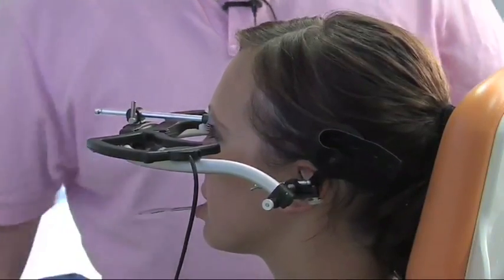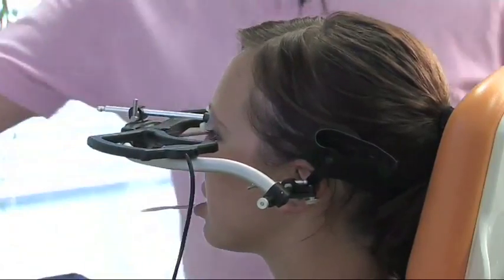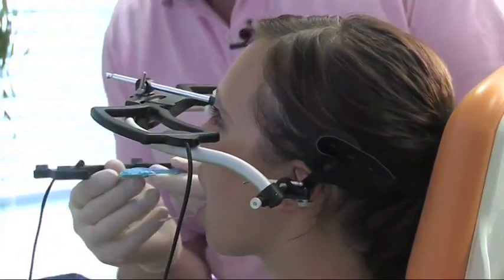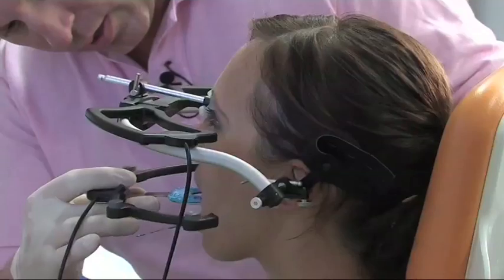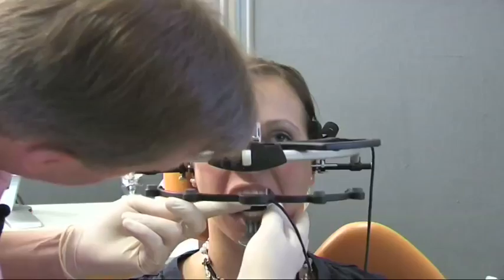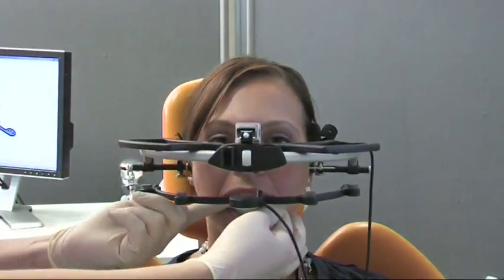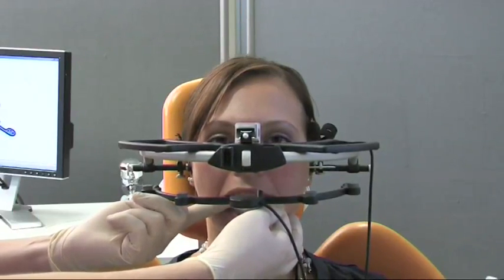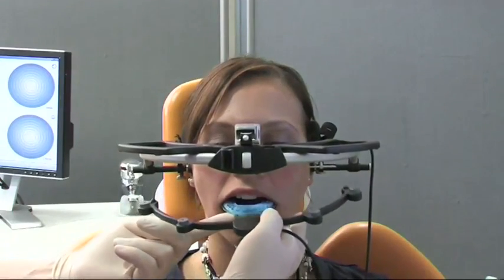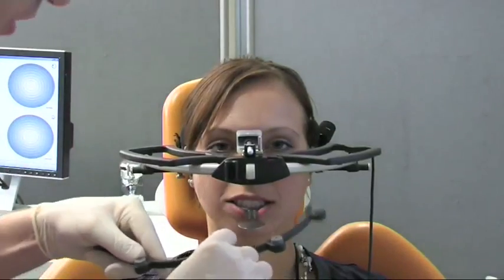So now we'll start the program. First of all, we will record how your upper jaw is positioned in your skull. Please open your mouth a little. Thanks very much. I'll now adjust this spoon to your upper teeth. I'll hold this firmly on both sides. You don't need to do anything, just hold still. Very good. Bite down, please.